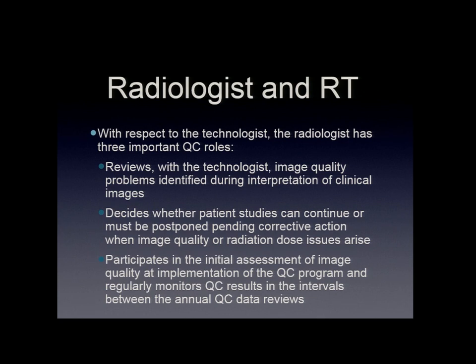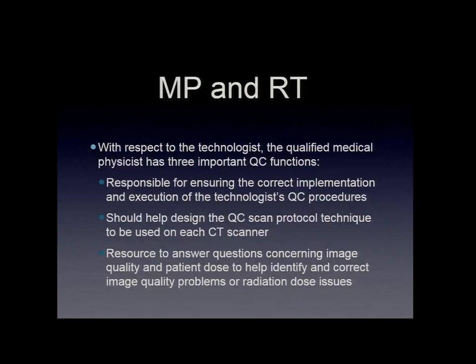And then, of course, initial assessment when you're setting up your protocols. You need to make sure that you have sufficient image quality and that the QC program is set up and that it is being maintained. The radiologist should be aware; I shouldn't come in after a year and see that there were outliers on the QC. The radiologist should periodically look at it as well to make sure he's aware of any things that might be out as well.